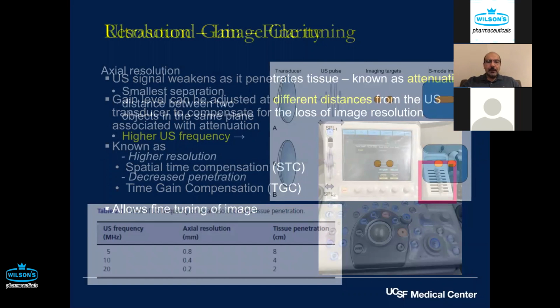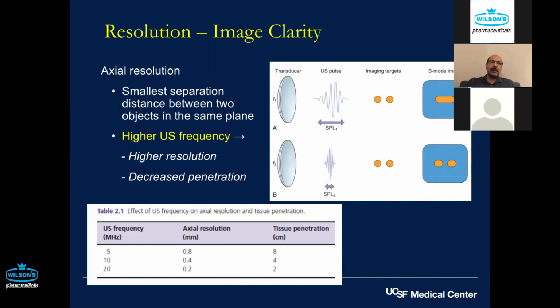So along with the brightness, the other concept to understand in endoscopic ultrasonography is the concept of frequency and resolution. And I think the concept here to understand is that if a wave is going through a tissue and there are 2 points across in the same plane, so imagine that you have the mucosa and submucosa.